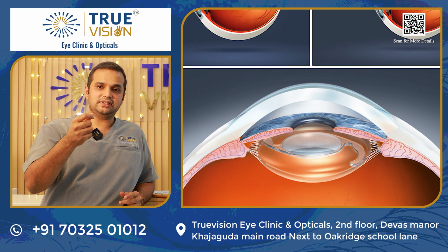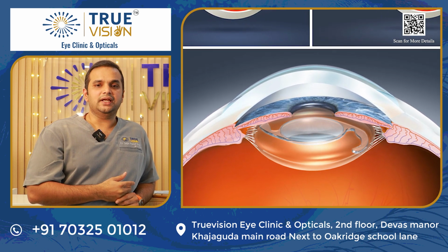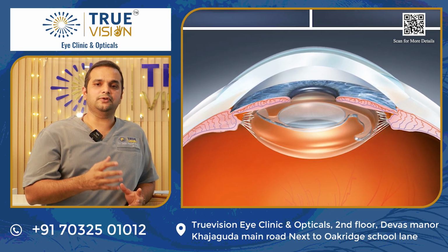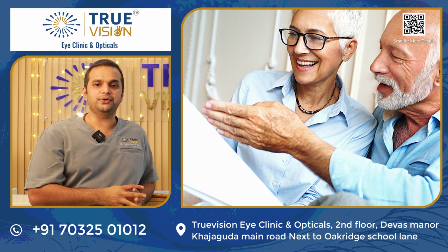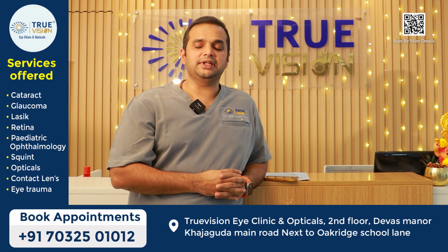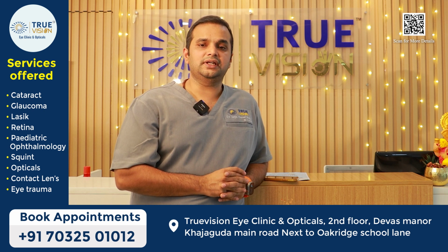Another thing is, because this lens is thicker than the usual lens, contrast sensitivity is reduced. So the ambient lighting in the room should be a little more than regular, so that it helps you in better reading. Apart from this, the lens has been beautifully accepted by patients, and the results are also fantastic.